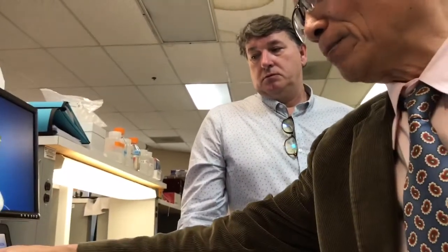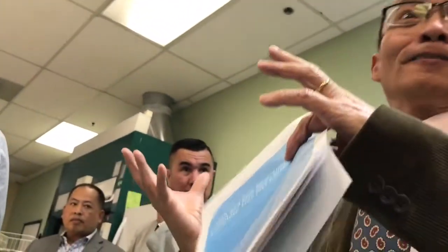Yeah, protein tests cannot do that. They can only give yes or no, disease or not disease. But this one can show how low or how high it is. It depends on the doctor. If they run more tests, then they can know how it goes. Like after 1 week, the patient falls from 5,000 to 500. So this patient, the treatment is good. It's working. And only the DNA test can do the viral load.